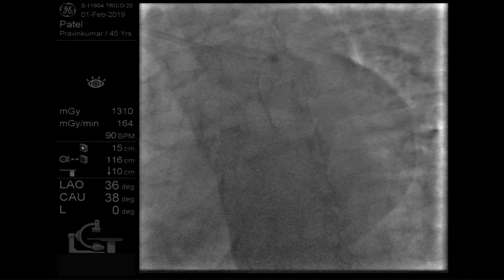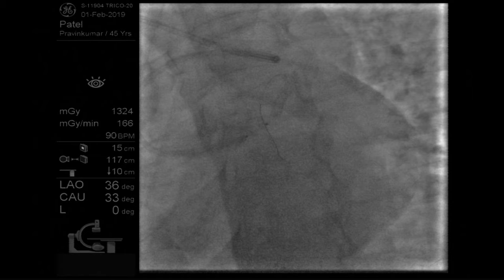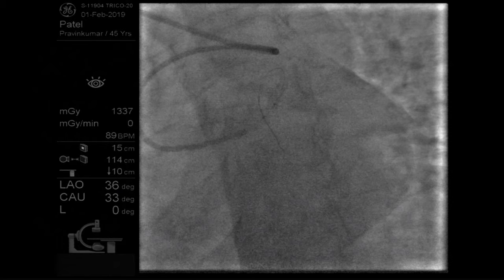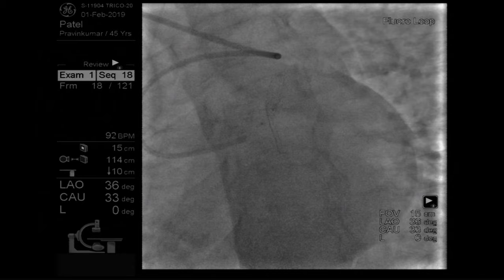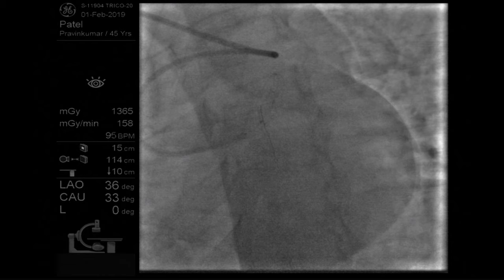What do you think of the segment between 30 and 40 on the OCT longitudinal view? There's a slightly narrower lumen there. But here is the lumen profile. The mean diameter change is eight. In the longitudinal view, sometimes the vessel is tortuous, and we cannot get a clear longitudinal image. So you would not go by the rendered image in this case. If you rotate here, we see it now. It looks better, much better.